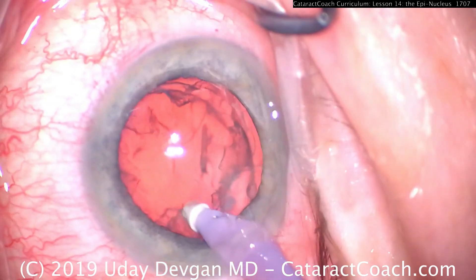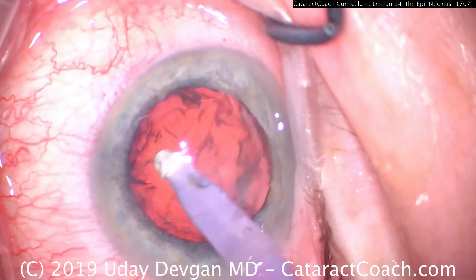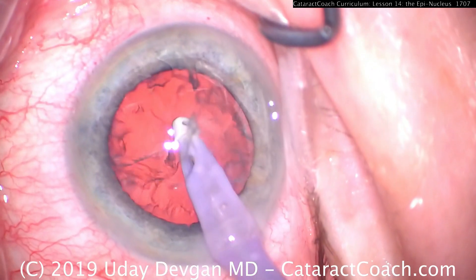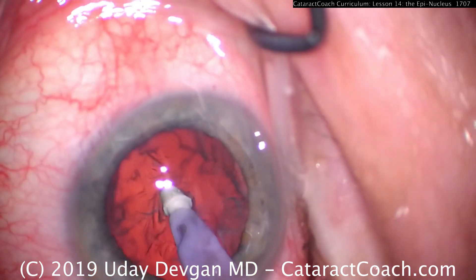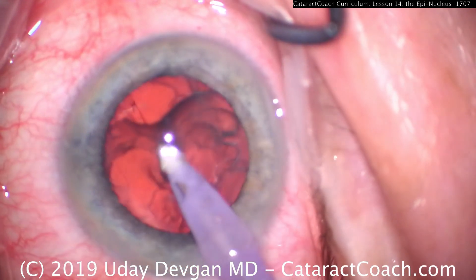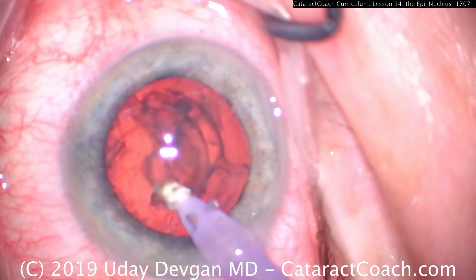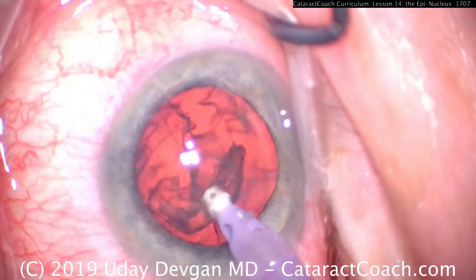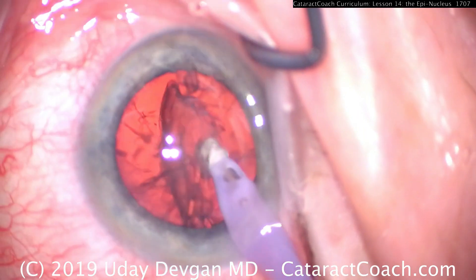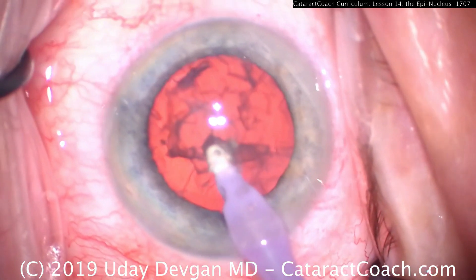We grab an end of it, try another end — it's pretty much freed, but we just have to grab an end. I'm having a little struggle, so we'll try something different: go right down the middle, get underneath it. That breaks that bowl shape of the epinuclear shell and splits it into two halves, and each half can be removed a lot easier. That technique was just using the IA probe to aspirate down the middle to split the epinuclear shell into two, and once it's split it's a lot easier to get out of the capsular bag.